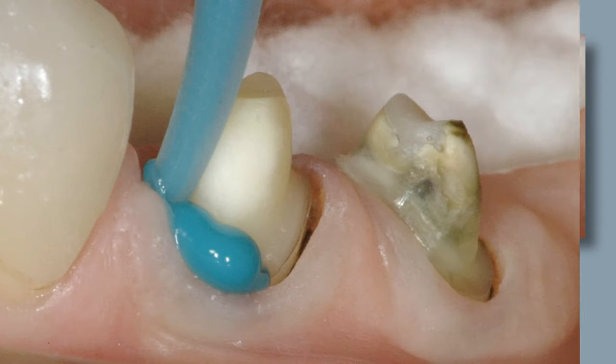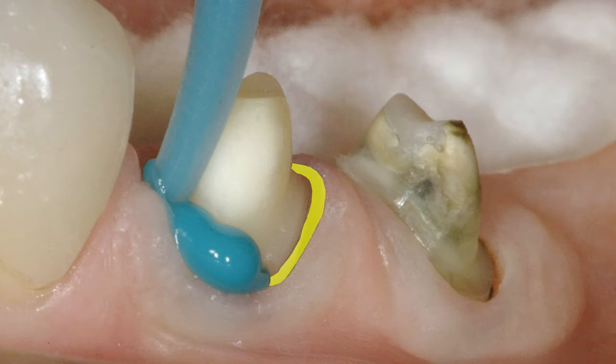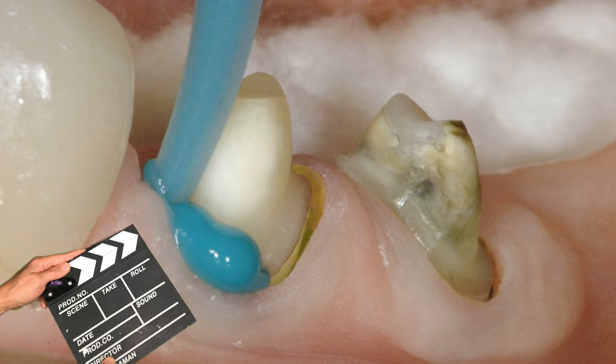Look at all that space we have here. You can see a wide space between the sulcus and the tooth structure itself. Sometimes you might even find a patient's car keys or a credit card they lost in there. We're looking deeply into the sulcus and seeing what we can see.